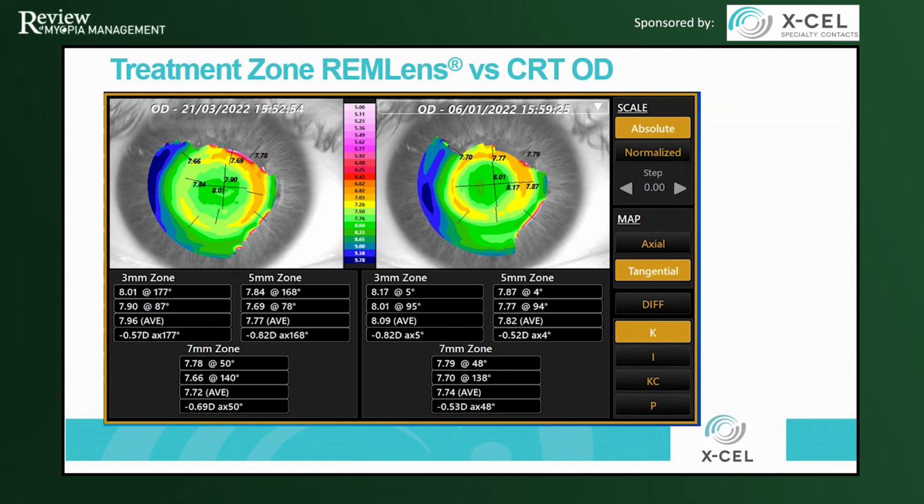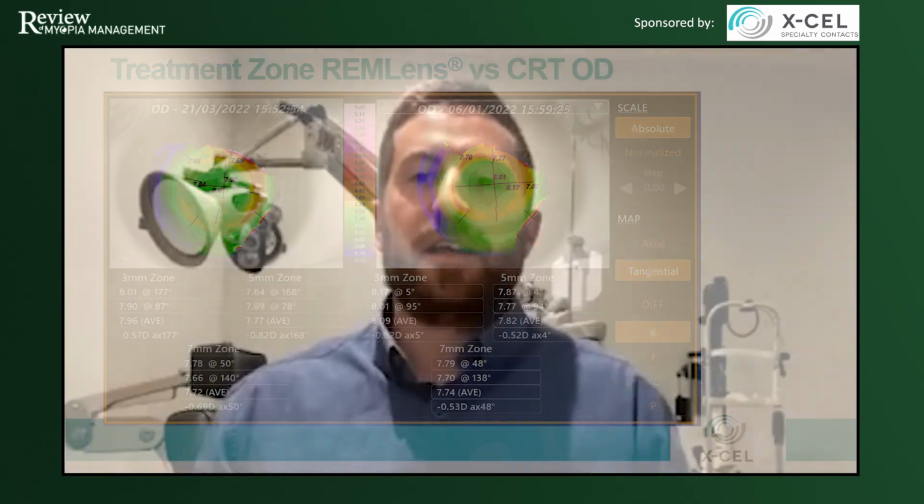So I've been steering a lot of my patients that are over 30 into OrthoK that are too dry for LASIK or too dry for soft lenses, because I myself, that's the reason I got into it. So that is one option where we can make the optic zone bigger to give them better vision, more like what they're used to in standard glasses and contacts. But in myopia management, it's important to be able to move the other direction.